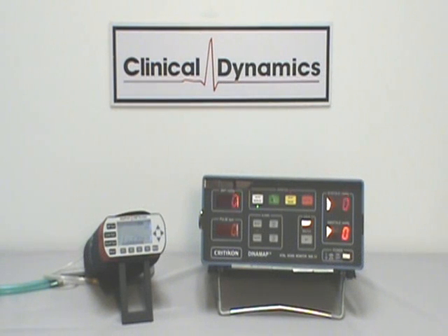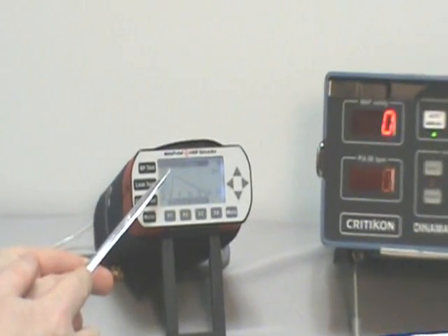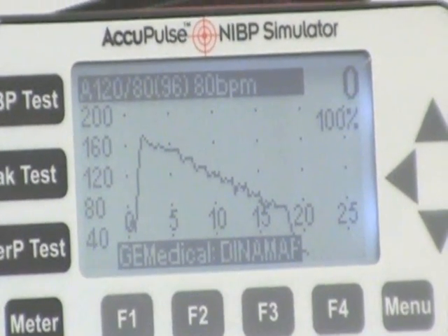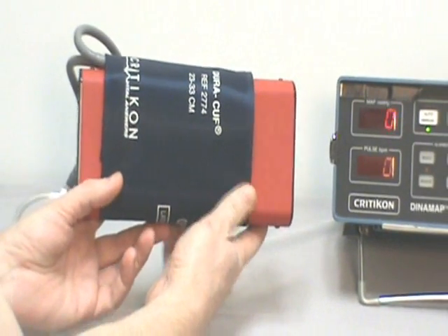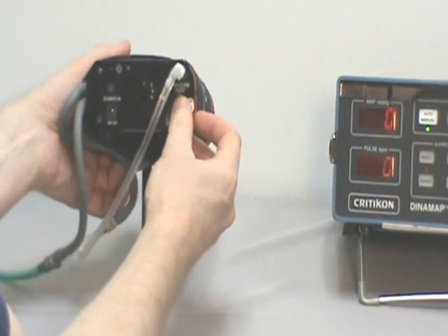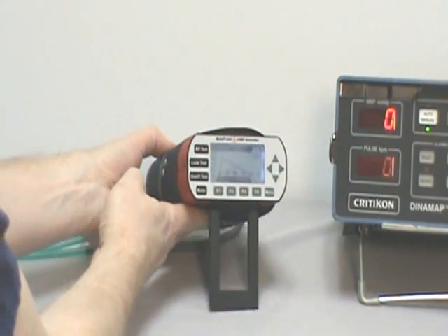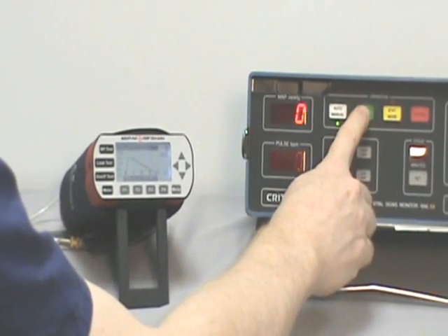This is a demonstration of the Acupulse non-invasive blood pressure simulator. In this demonstration, the Acupulse has been configured to generate a blood pressure of 120 over 80 with a pulse of 80. Initially, the system is set up where the cuff is wrapped around the body of the Acupulse and the hosing is connected to the pressure sensor port. Once configured, the blood pressure measurement is initiated.